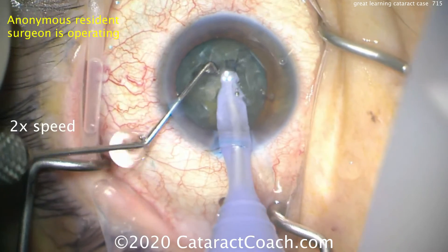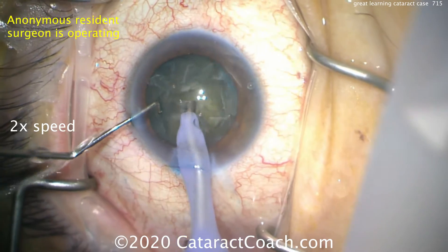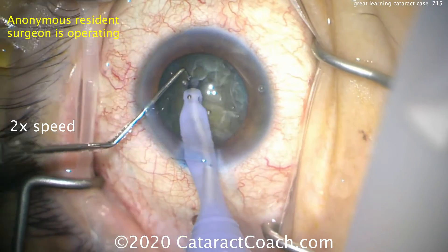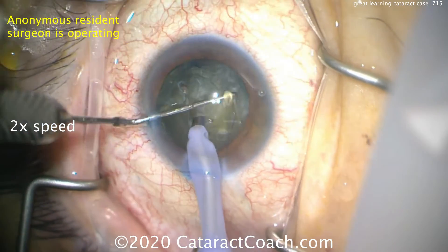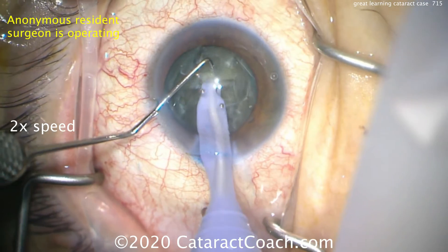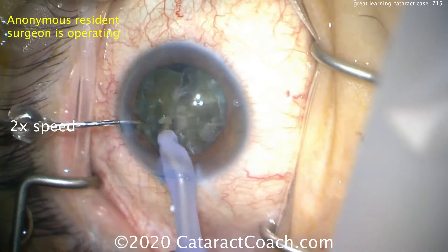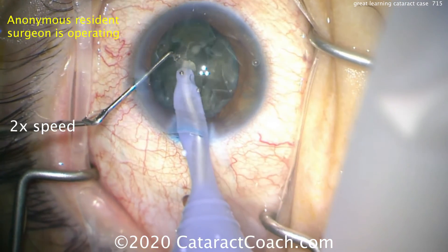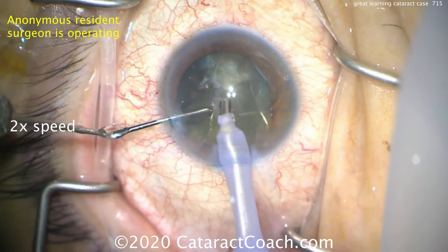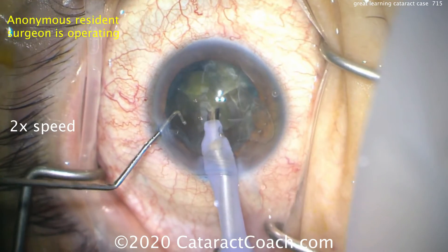Now splitting the nucleus — it needs to be split a little bit more. It looks like trying to bring a half out; not sure if that's going to happen. You can see the resident's having a tough time with that. What would you do now? You can try again — buzzing in, trying to bring out the half. I don't think the initial crack fully propagated, and I'm not sure there are two distinct halves. But that was a successful chop. And there's another chop — now we're in business. This is a stop and chop: initial groove, two halves. Not a complete separation, but it was okay.